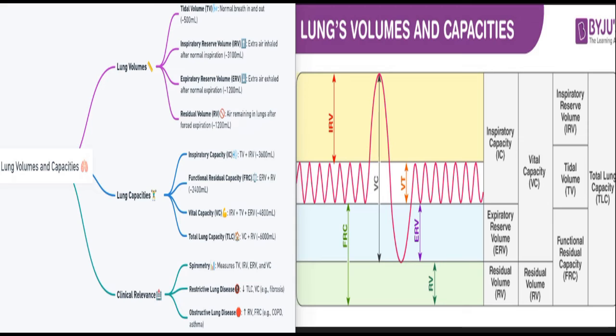It's measured from a segment of the forced vital capacity, which includes the flow from medium and small airways. So the forced expiratory flow of 25 to 75% is an indicator of early onset small airway narrowing.